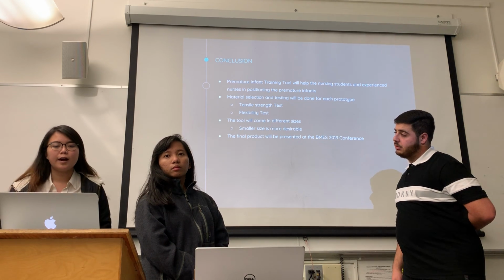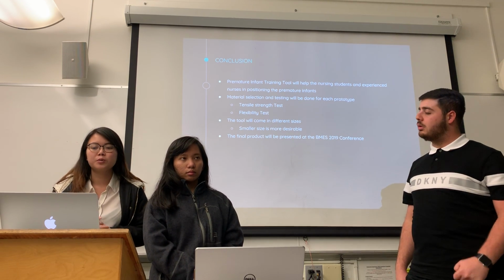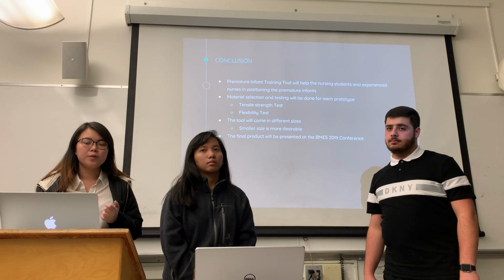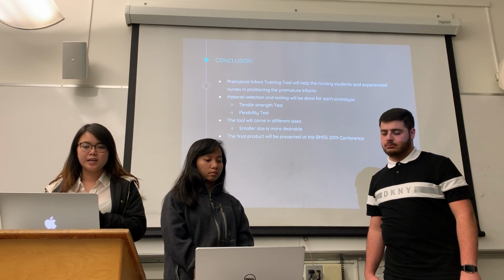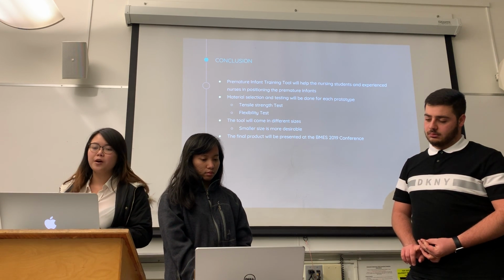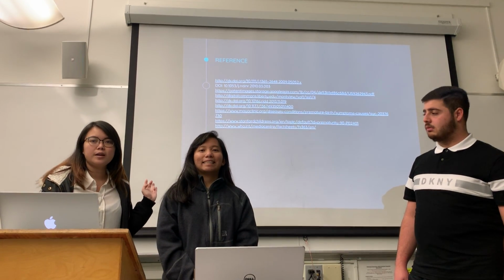So in conclusion, our premature infant training tool will help the nursing students to increase their experience with positioning the premature infant, and the material selecting and testing will be done for each prototype. The tests that we'll be conducting are the tensile strength test and the flexibility test. The tool will come in different sizes, as Mo and Maria mentioned, so we're trying to go as small as we can. And the final product will be presented at the BMES 2019 conference. And our references. Any questions?